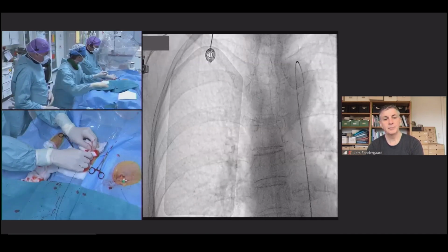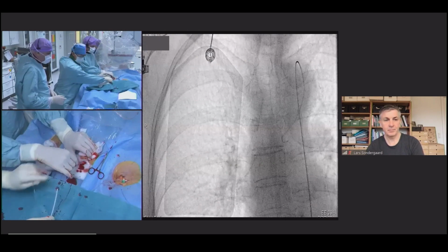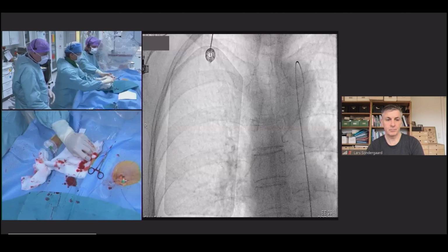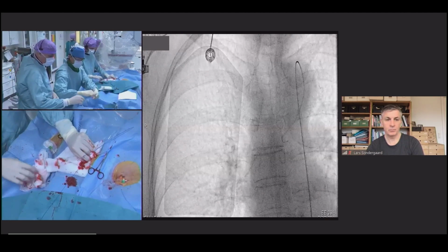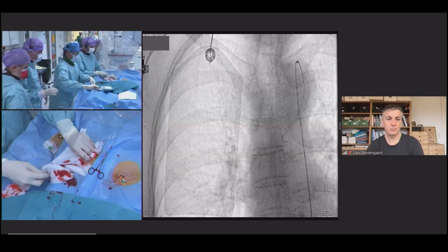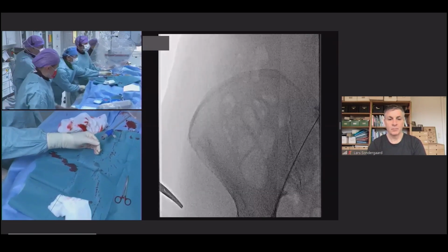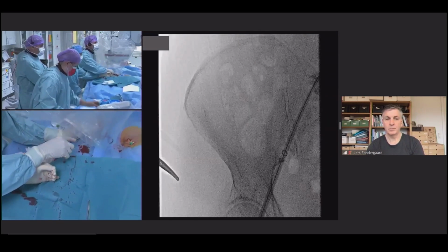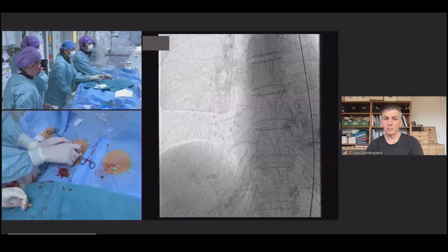So this Hydra 26 millimeter delivery system is comparable with a 14 French sheath. So that's why we're starting with a 14 French sheath here. We use the Sentrant sheath from Medtronic, which I think has a nice profile, and also it's quite hydrophilic. We wouldn't expect any major issues here because the vessel was quite large and non-calcified, and you see that 14 French sheath is coming nicely up.